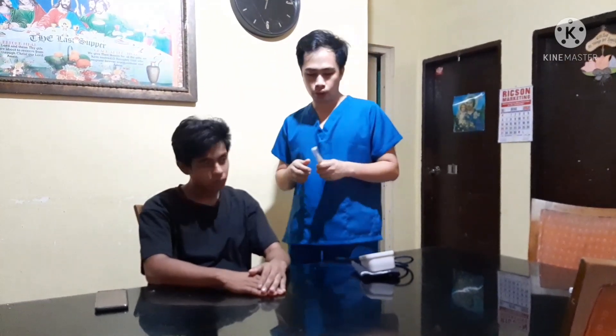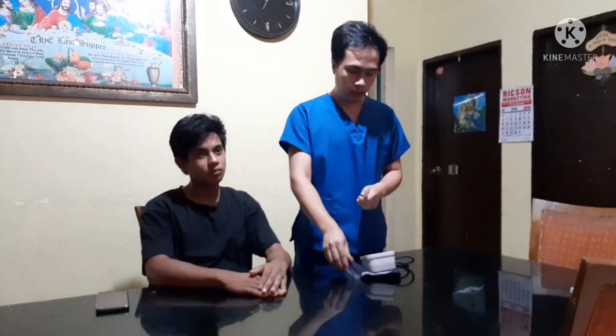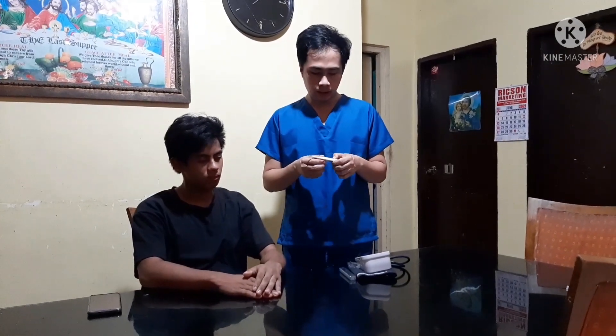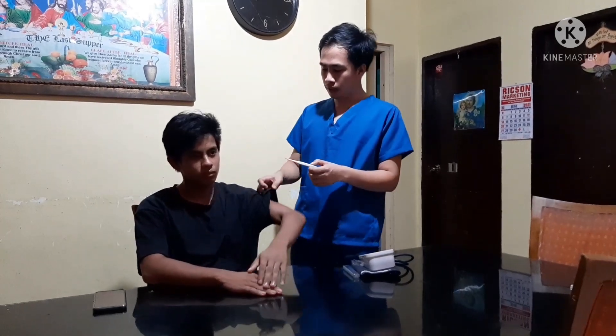First, we will take the patient's temperature. We will be using a thermometer. We will turn on the thermometer and insert it in the patient's armpit.